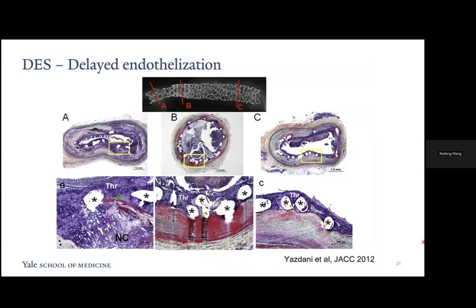So, why is drug-eluting stent not as promising in vein graft PCI as compared to native arteries? It's generally thought that the problem with drug-eluting stent in vein grafts is that re-endothelialization takes even longer. So it leads to higher rates of uncovered stent struts. This is an interesting pathology slide on a patient in their 80s who passed away. And so this is an autopsy. And this patient had drug-eluting stent placed 2 years before their death.